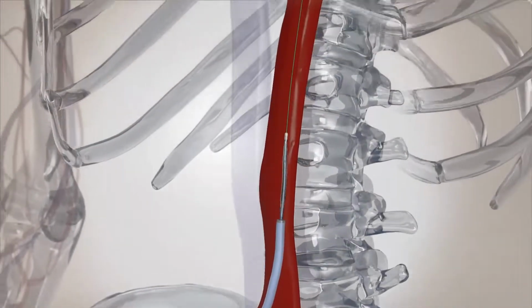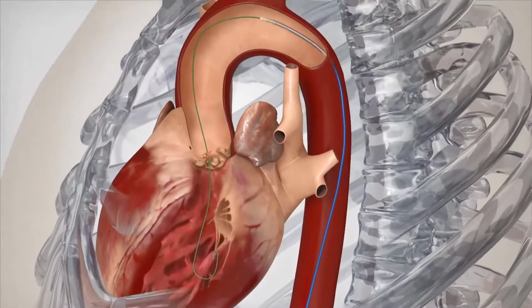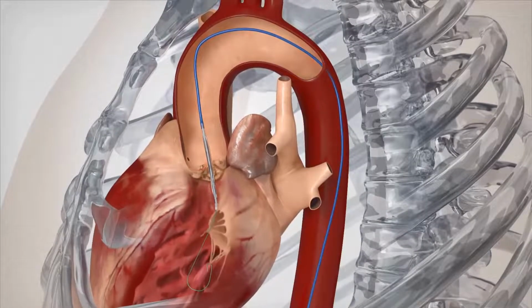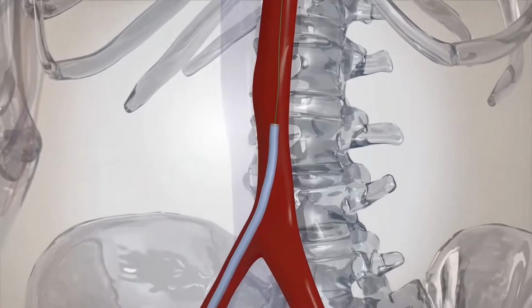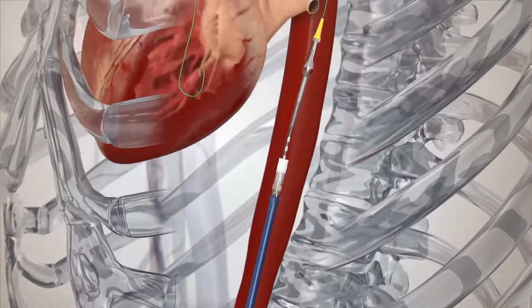And here's a video of the procedure. Essentially, we look at the blood vessels, and if they're big enough, we go from the groin. Most cases that we do are from the groin lately because it's associated with the best outcomes. So you go in, you cross the valve, and this is the balloon aortic valvuloplasty I was telling you about. You pace the heart at a rate of 160, 180 ballpark. You inflate a balloon, make some room for the valve to come in. We still do the ballooning in certain cases, but we've gone from almost 100% use of balloon aortic valvuloplasty pre-valve deployment to maybe 5-10%.